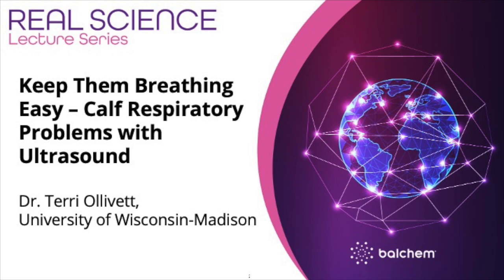On the West Coast, folks that are using lung ultrasound regularly are using it more as a culling tool later on. So they can find animals that are performing subpar, have been treated multiple times, or still have chronic lungs, and they're going to cull them at 4, 5, 6 months old versus keeping them all the way until they get pregnant, get bred. If they do keep them, we do know that these animals will get bred later, they will calve in later, and they will be more likely to have dystocia, and be less likely to make it to their first lactation. So there are these long-term impacts of having disease, ultrasonographic disease, in the pre-weaning period.